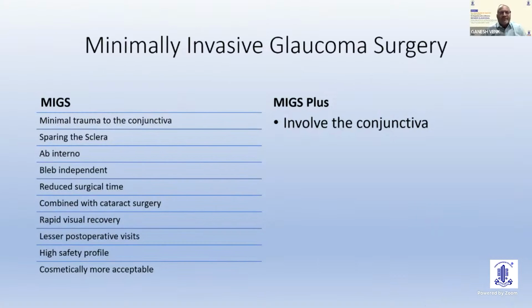So that is so much for the investigations and the non-surgical procedures. Now we'll come to the surgical procedures, where the recent advances include minimally invasive glaucoma surgery. The advantage of minimally invasive glaucoma surgery is that it causes minimal trauma to the conjunctiva.